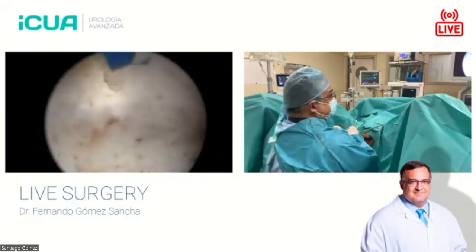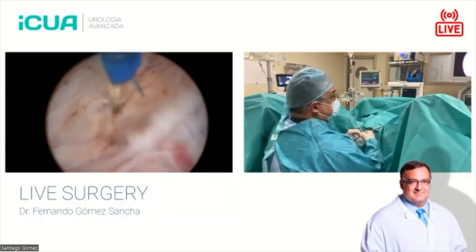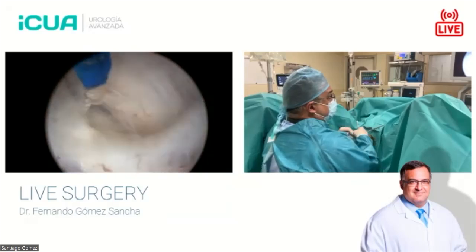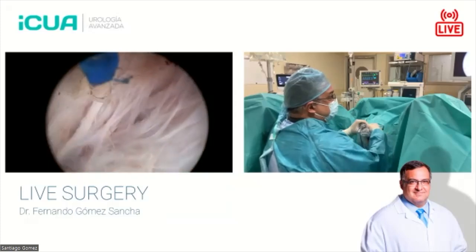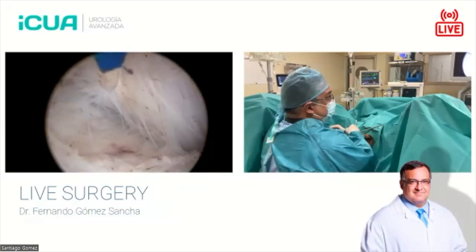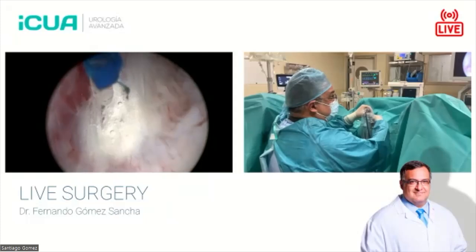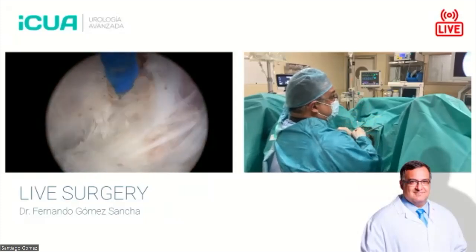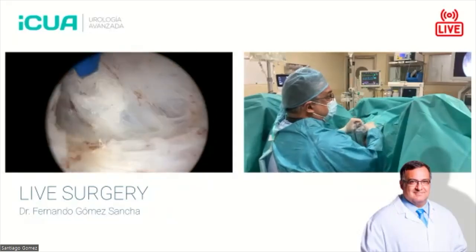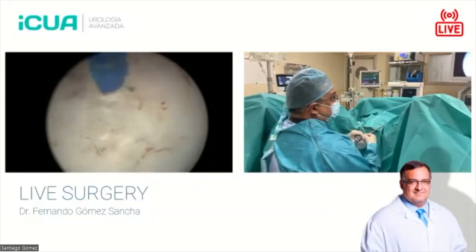You see that most of the operating time happens with the activated laser. This is why the procedure is so fast, because there's very little pausing time. So you can work, and I have worked with low power for a long time in Bulgaria, and I have to say I hate it, because I don't think it is relevant for the patients, but it is certainly relevant for the surgeon. If you have the ability of having 2 joules and maybe a higher frequency, the quality of hemostasis will be better, the quality of the dissection will be better. So I think you can, but I wouldn't recommend it for a center that is going to do a lot of cases, because hemostasis probably is more difficult to keep.